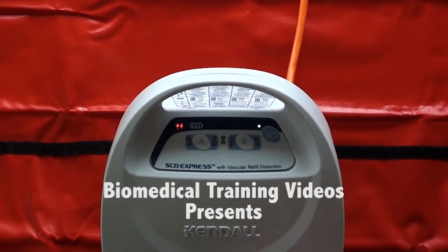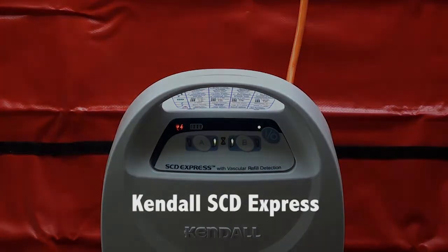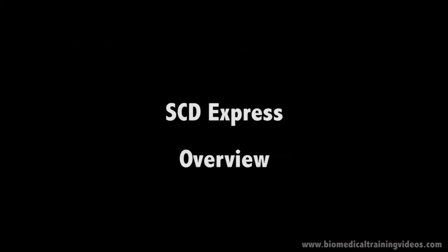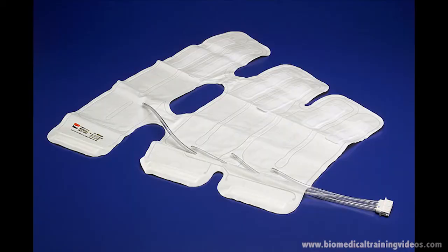Hello folks and welcome to the Kendall SCD Express. In this video I am going to talk about some clinical aspects of the unit and also cover a functional test. The SCD Express is used mainly to prevent DVT in patients who generally are immobile for an extended period of time.